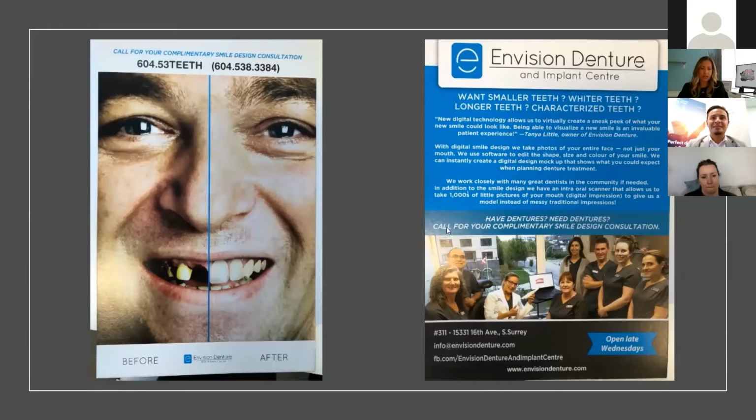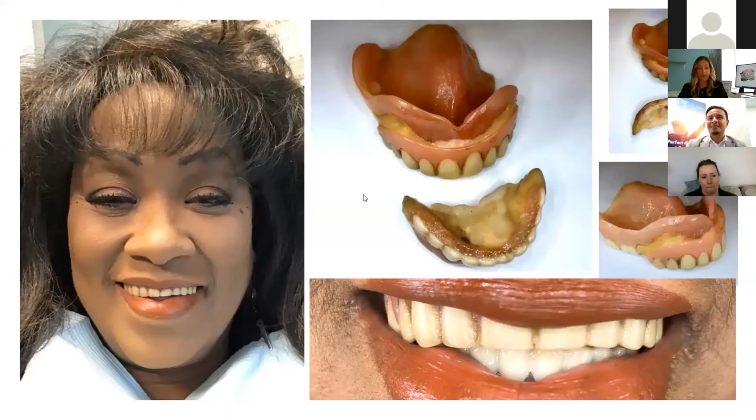This was our Christmas case. Really something. We saw her last winter, and she presented with exactly what you can see here. These were mail order teeth, essentially. This was an acrylic partial that she had made once upon a time, and she ended up losing those teeth on the upper left in quad 2, and never had it taken care of properly. The lower teeth failed, and she just kept on MacGyvering whatever she could via mail order teeth. Honestly, she did a pretty good job in lining up her occlusion, because when she closes together, she's jiving.